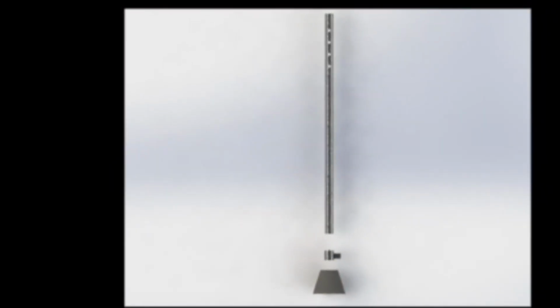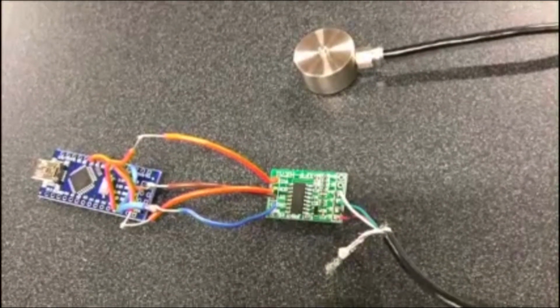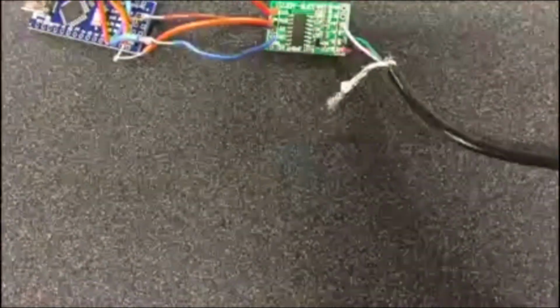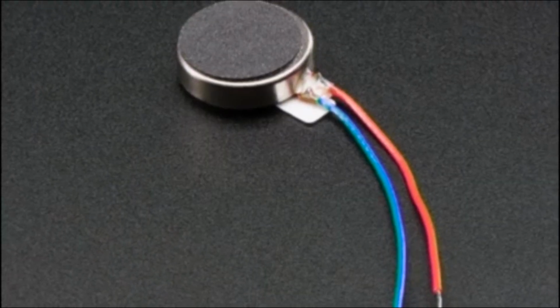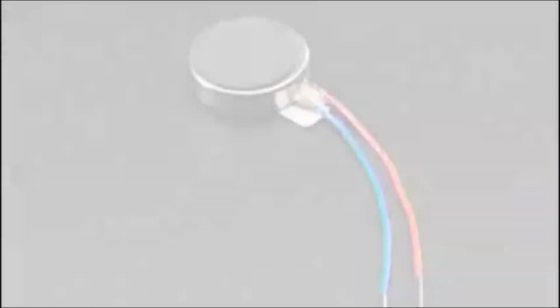My thesis project is to design a device to be incorporated inside forearm crutches to measure weight exerted through the crutches and compare it to a predetermined threshold. By using force sensors and haptic motors, the user will get instantaneous feedback if they're applying too much or too little weight on their affected limb. Having such feedback instantaneously would decrease the chances of overloading and therefore result in more efficient and effective rehab.